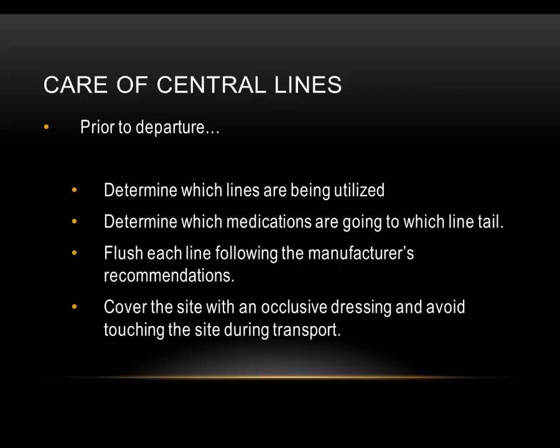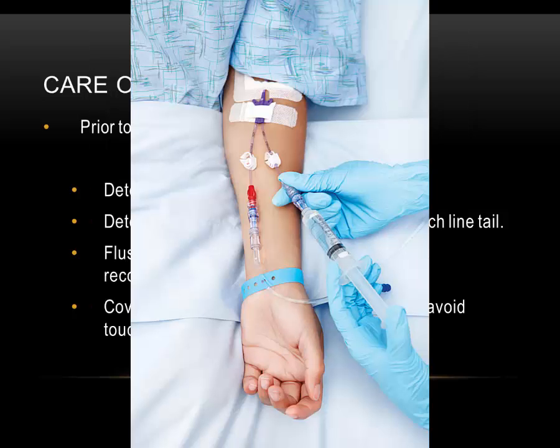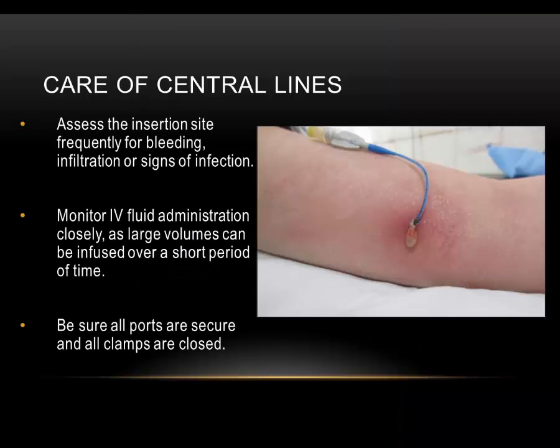Use a 10cc syringe. This generates proper intralumen pressure for flushing. Adopt a push-pause technique when flushing. Some catheters are for saline only. When transporting a patient with a central line, you should alert the doctor immediately if there is any discharge, redness, swelling, or pain around the catheter insertion site.